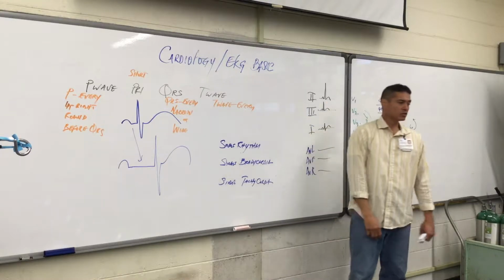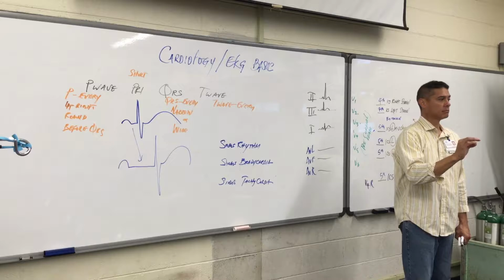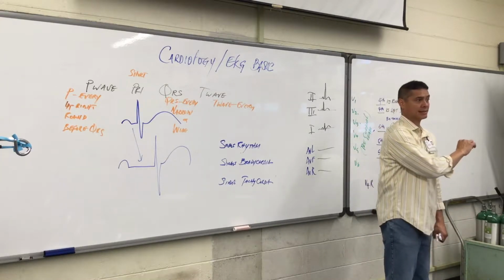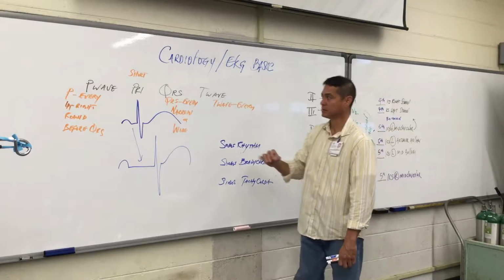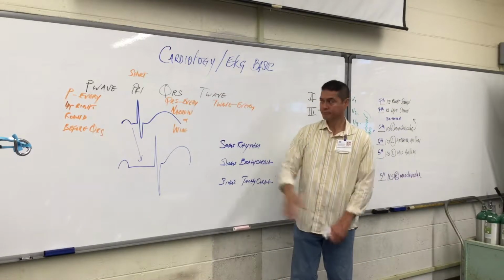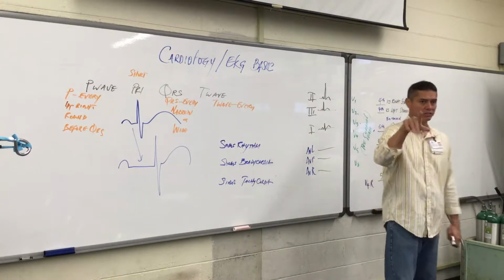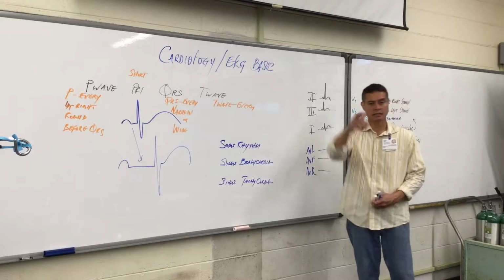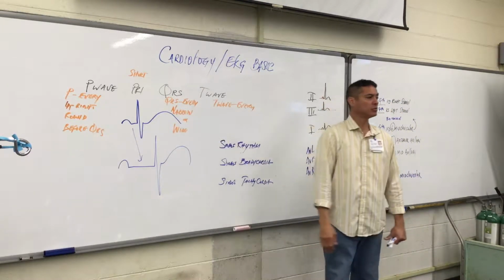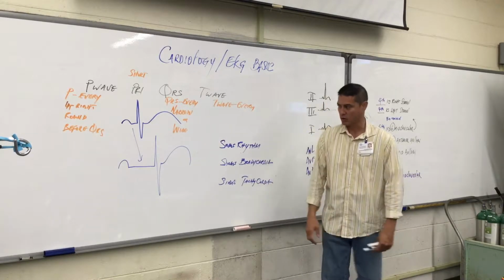And if it's a sinus rhythm, every QRS complex looks exactly the same. From the previous one to the one that came next, they're all the same. There should be a QRS complex for every P wave. They should be narrow. It should be very thin. Some of us have seen this on some of the generated EKGs from the mannequin, it's a very narrow QRS complex. It should be nice and narrow. But I put down, or it could be wide, and you're saying, well, what is wide?